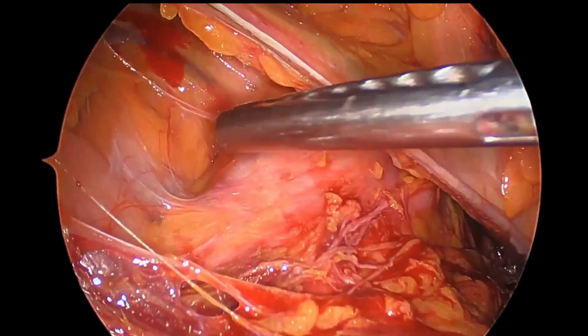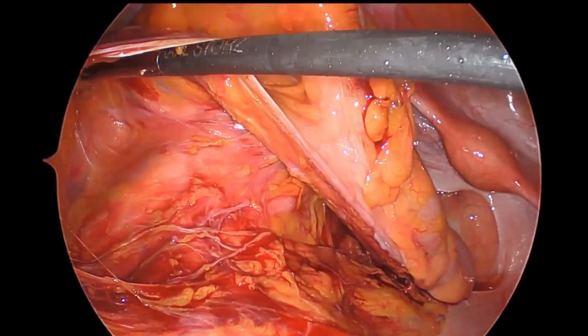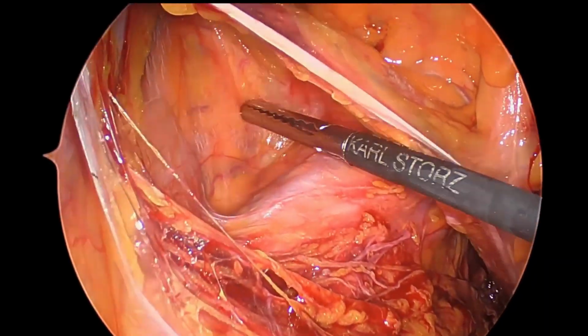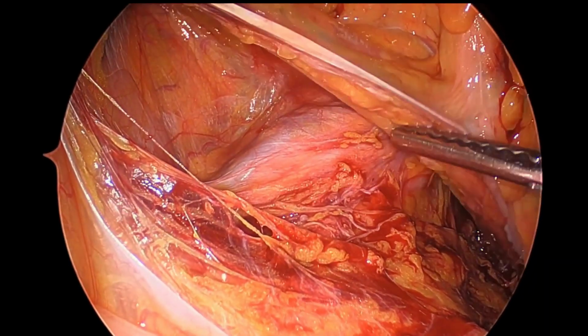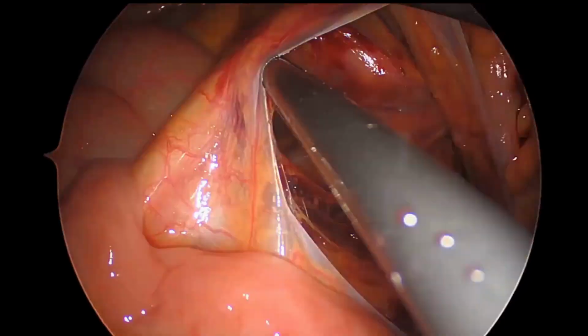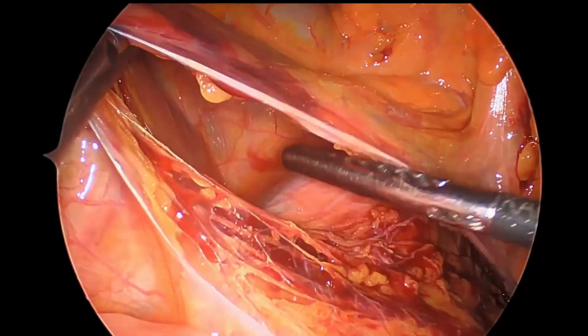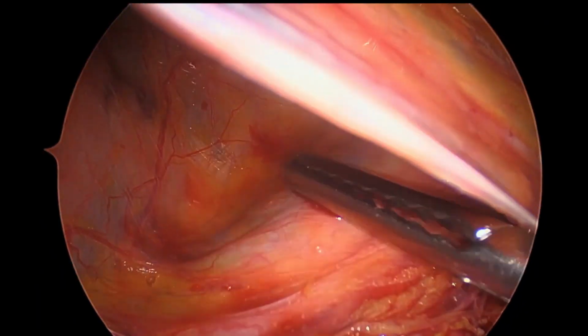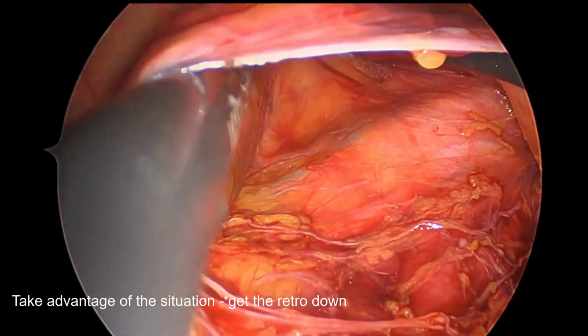function. And you can really see that white line of Toldt, the line separating retroperitoneum quite nicely, and we're sweeping that away. The sweeping motion is again supposed to be kind of a C motion, sweeping in broad strokes down. And I was just pointing out there where we'd gone too deep. There's the ureter that you saw vermiculate again.